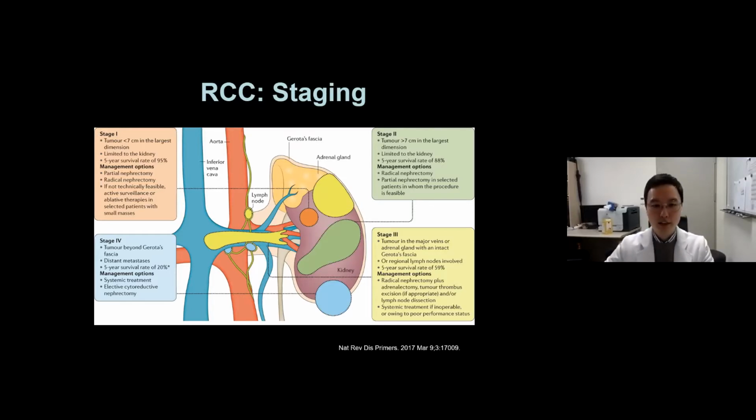So why is this important? Our imaging, or also FDG PET, can have important implications, for instance, in detecting stage 3. Whether there is a tumor thrombus in the inferior vena cava is also important, and if it extends into the chest above the diaphragm, there is a need for cooperation with the thoracic surgeon. So it is very important for imaging to indicate the extent of the tumor thrombus.